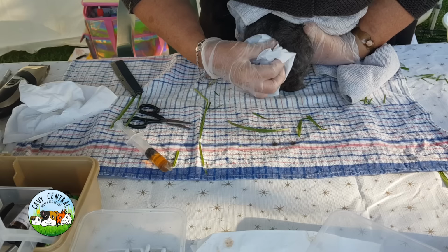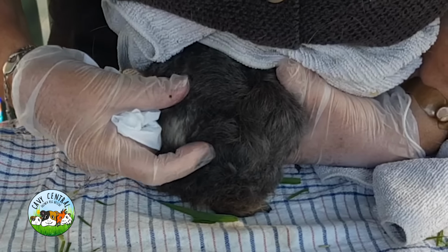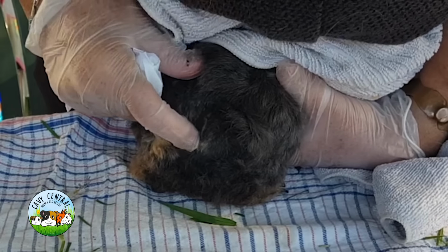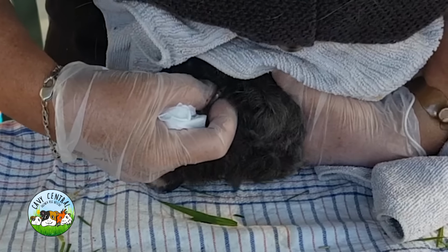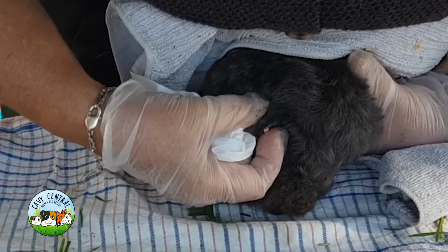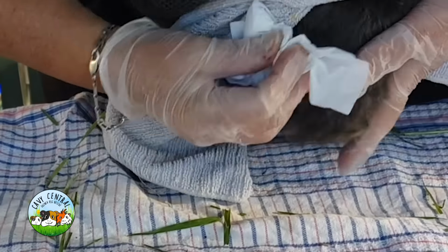Okay, just one more flush. Now, if you look really carefully, you can feel and see the flatness in line with the shape of her body. There's nothing there. Oh, there we go, a little bit from the bottom coming up again. But then just make sure all of it is coming up and out and away. This is all infected material. There. Okay.